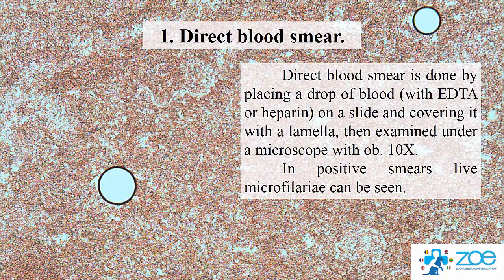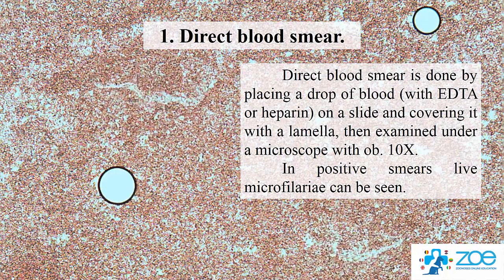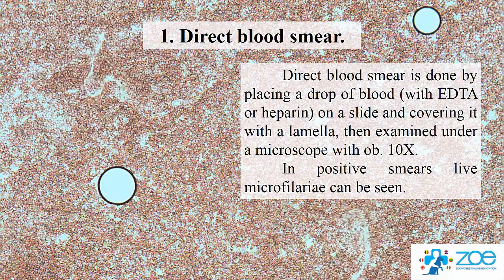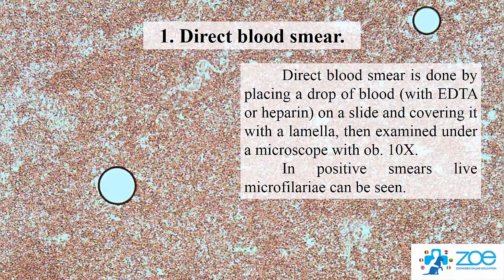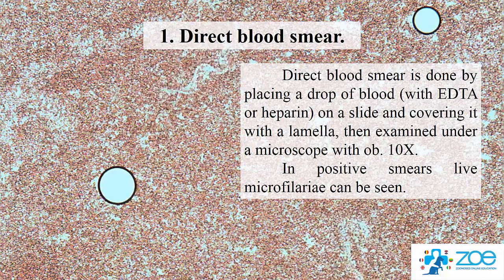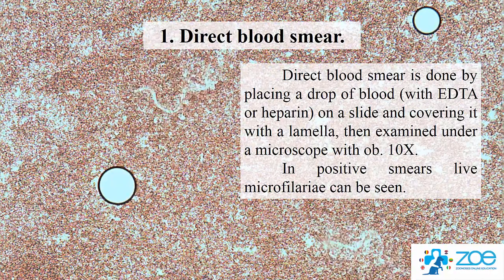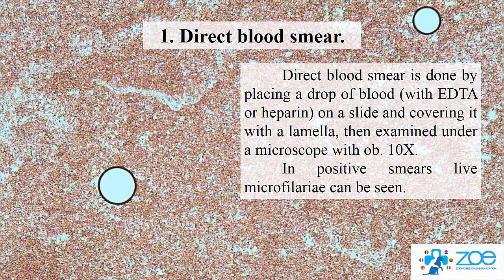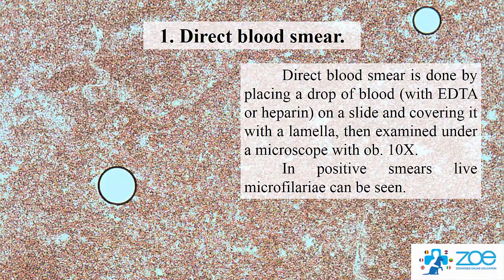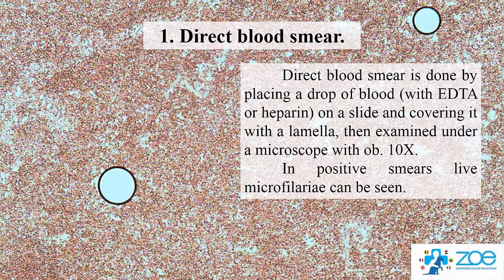Diagnosis protocol of Dirofilaria infection: direct blood smear, modified knot test, serological tests, diagnostic aids such as echocardiography and radiography, serum biochemistry tests.